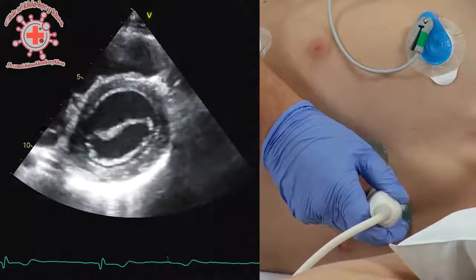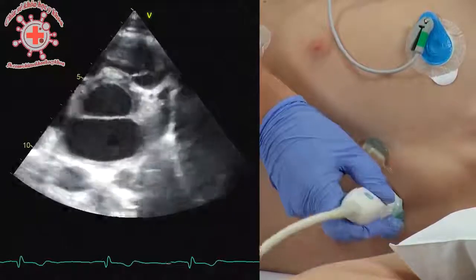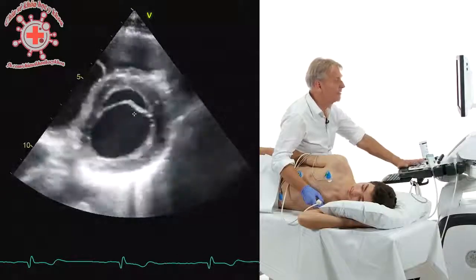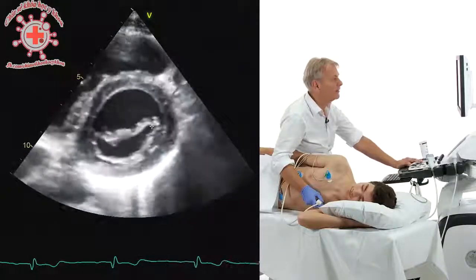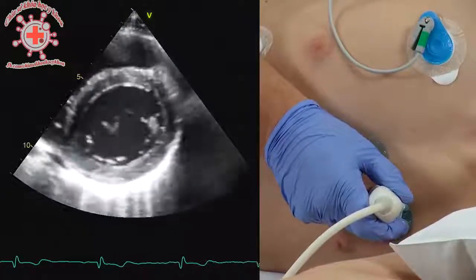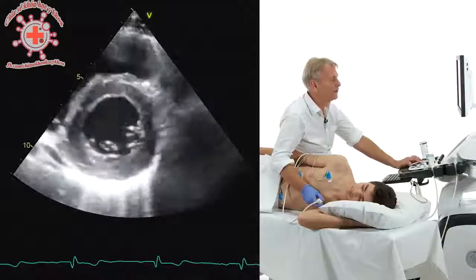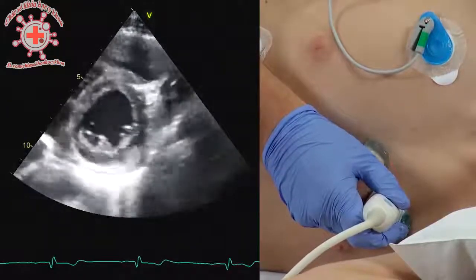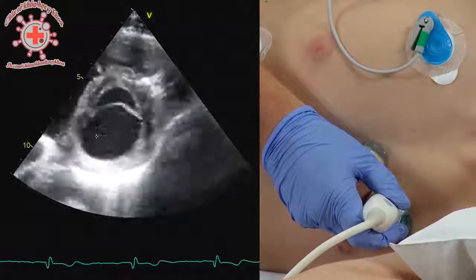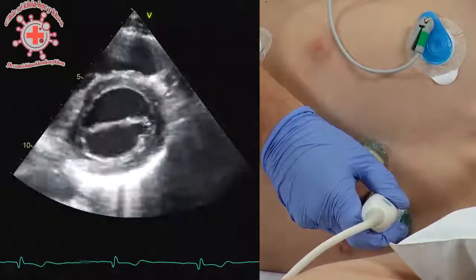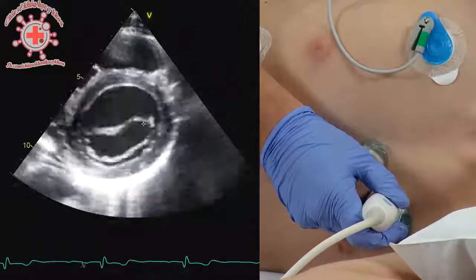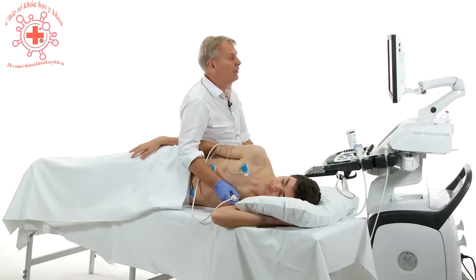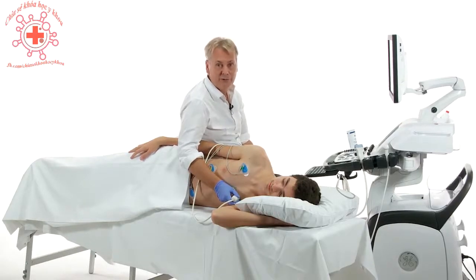Let's image the mitral valve in a short axis plane. Make sure that you don't over-rotate or under-rotate the ventricle — try to have the ventricle in the center of the image; you can correct that by moving the transducer either towards the left or towards the right. Try to see that the anterior leaflet is not discontinuous, because if it is, you are a little too far towards the apex — that's where the chordal structures insert into the anterior leaflet. In the optimal view, you will nicely see the mitral valve open like a fish mouth, with the anterior leaflet up here and the posterior leaflet here. Note that you can nicely appreciate the anterolateral commissure and the posteromedial commissure.